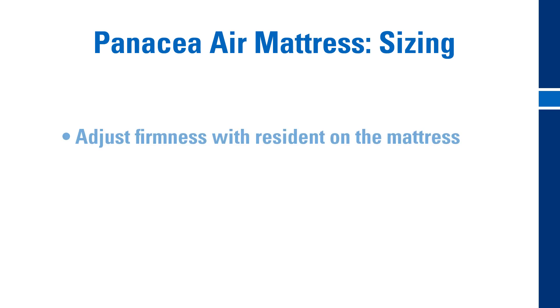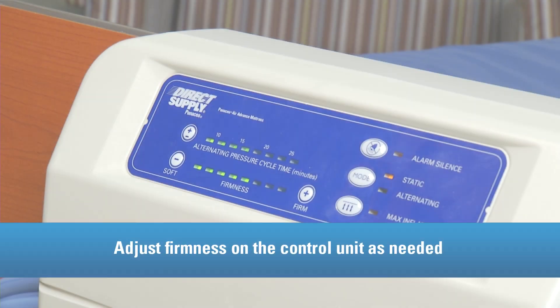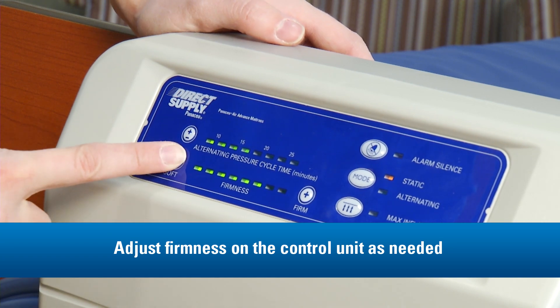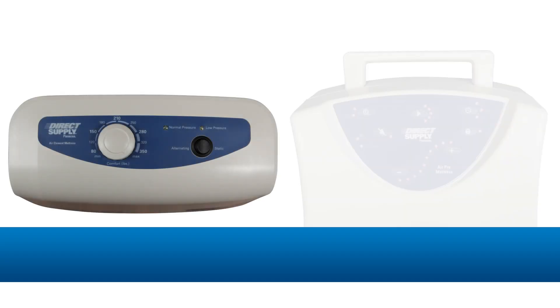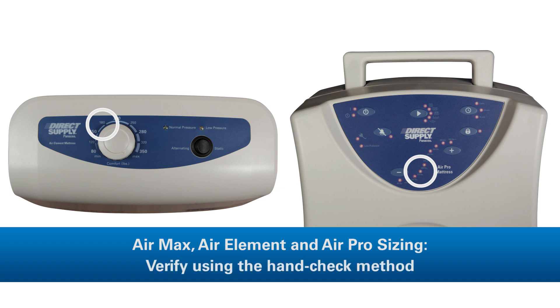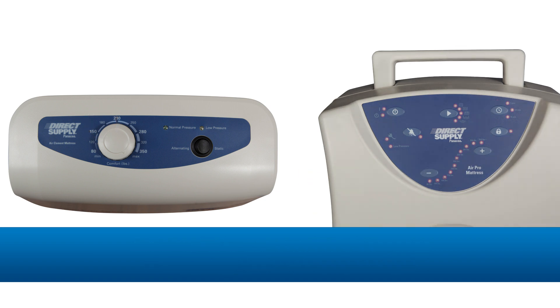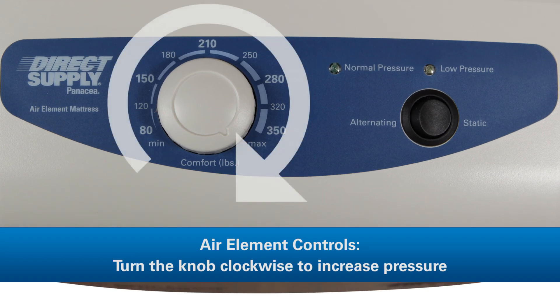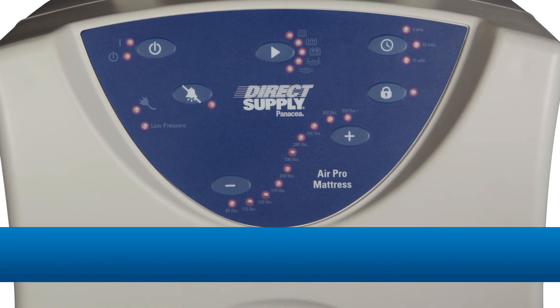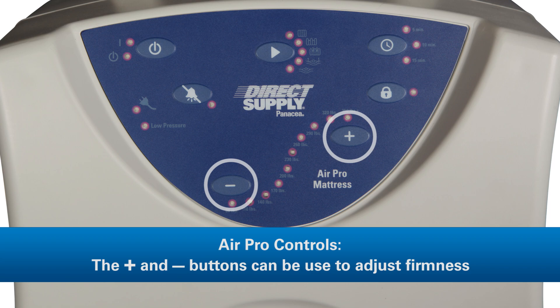With the resident on the mattress, adjust firmness on the control unit as needed to achieve resident comfort, support, and appropriate immersion. When adjusting the pressure on the Panacea Air Element and Air Pro, first set the unit to the resident's weight. You'll want to verify this is the most suitable setting for your resident by using the hand check method. For the Air Element controls, turning the knob clockwise will increase the pressure, while counterclockwise will decrease it. For the Air Pro, the plus and minus buttons can be used to adjust firmness.